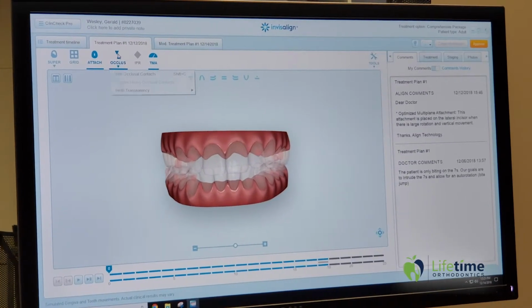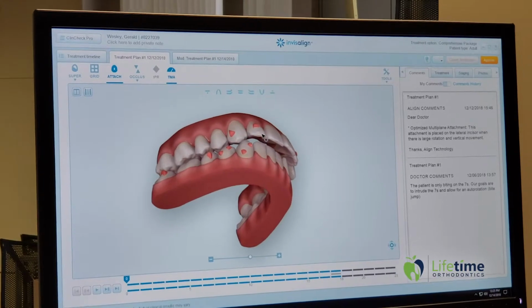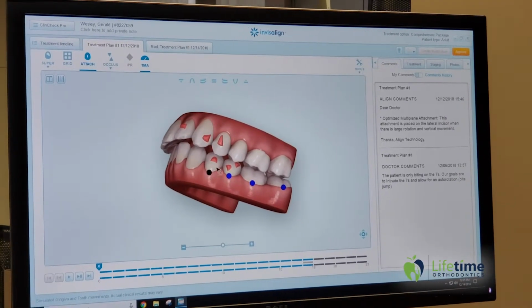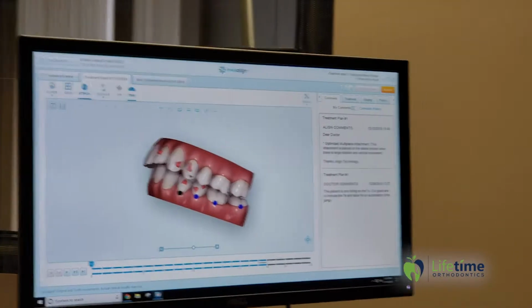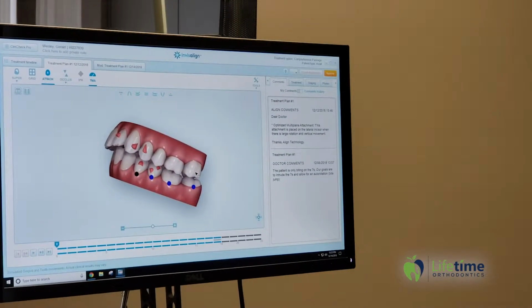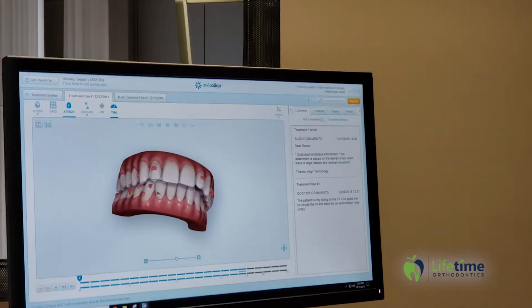Now if I go here, you can see this huge, what we call overjet, okay? And you can see that my teeth don't line up. I often say, do the teeth come together like gears or like rocks, okay? And you can see these are more like the rocks here. And so that's causing all kinds of wear and tear of my teeth, as well as some jaw joint issues in myself as well. So I'm going to aim to correct my bite here, all right?